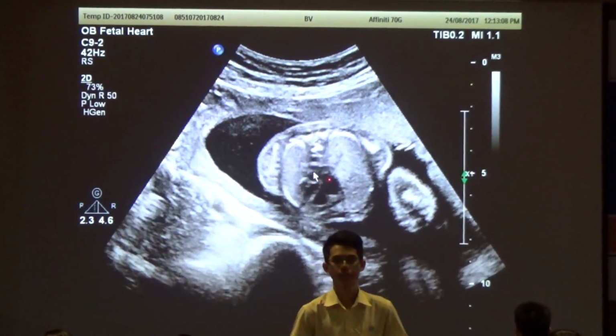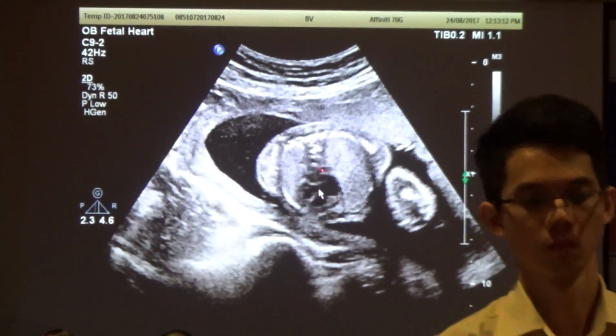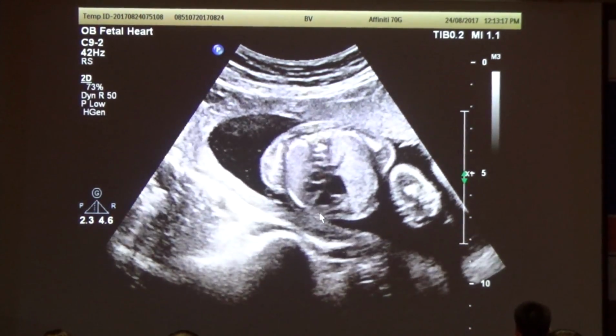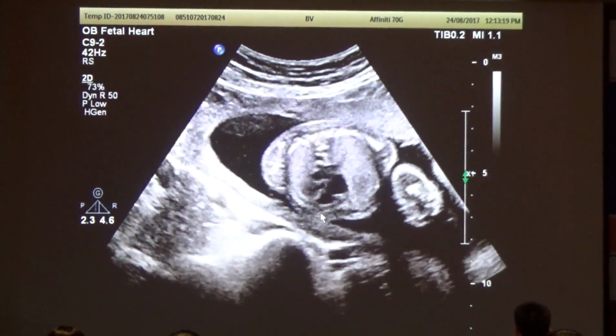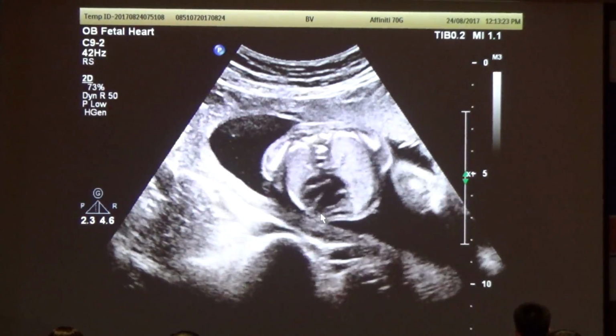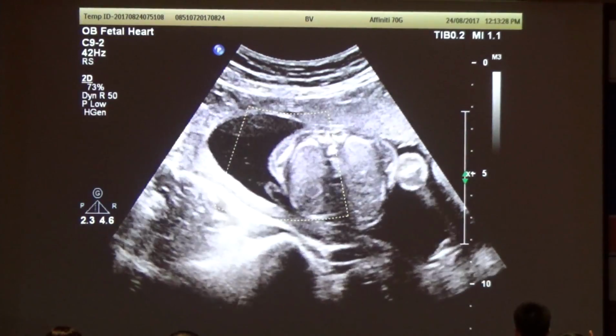Okay. This is very important because once you see this, you've excluded total anomalous pulmonary venous return. Nếu mình thấy được cái này thì mình có thể loại trừ được cái bất thường hồi lưu tĩnh mạch phổi toàn bộ. This is much better than we saw yesterday. Is it due to the machine or the patient? Which one do you think? I think it's the patient.